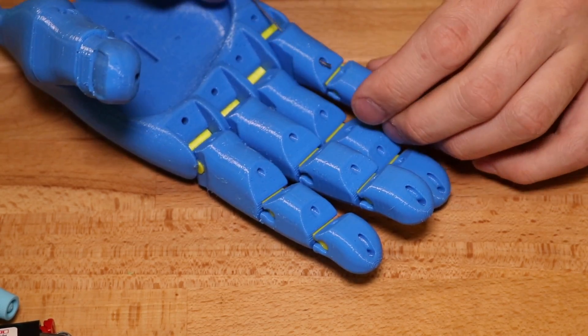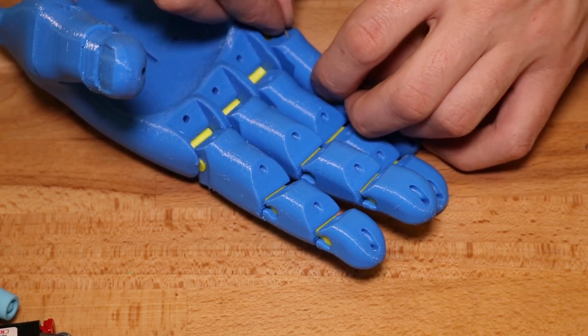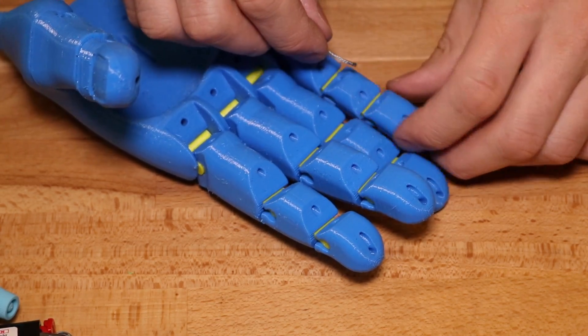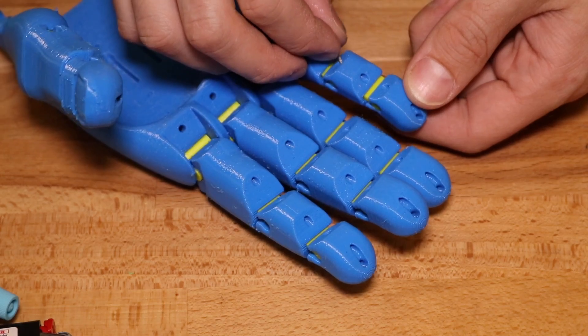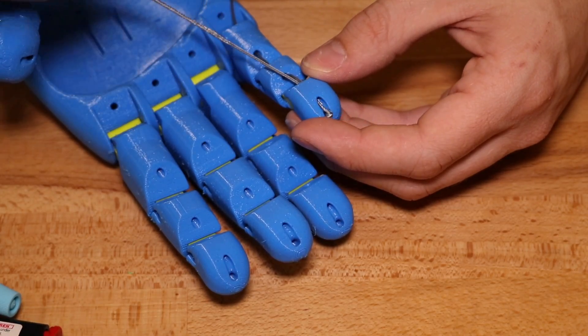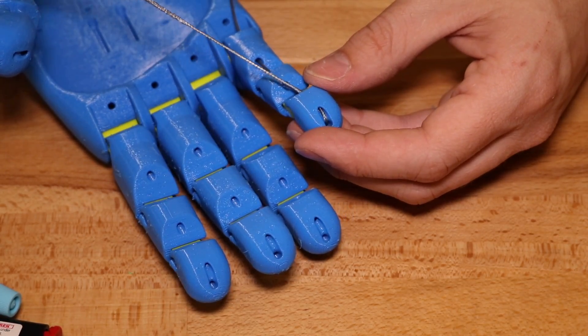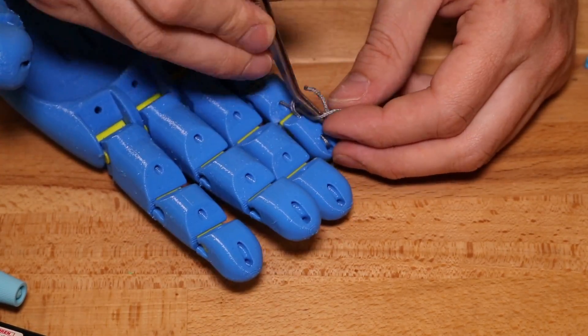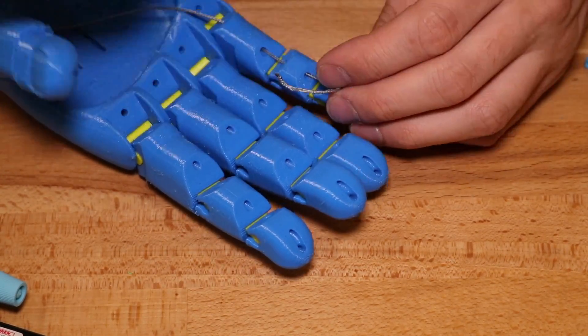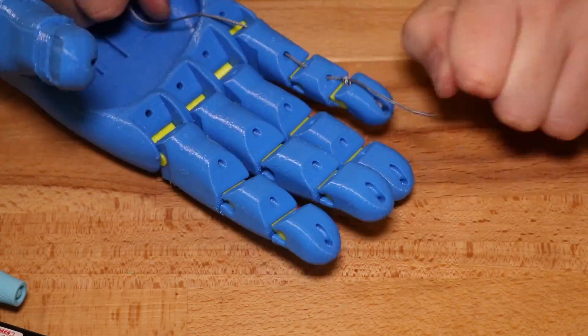Now it's time to thread a small amount of nylon fishing wire through the holes in each finger — this is what's used to actually close the finger and give the articulating motion when the wrist is closed. Once the fishing line has been threaded completely through the fingertip, roll it back on itself and tie it into a knot, sealing it off at the end.